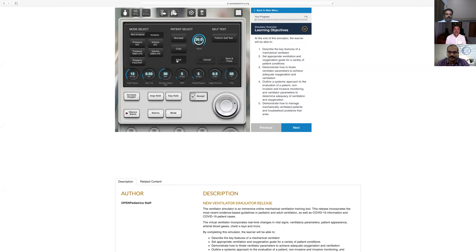Now I have to select the adult, then go for volume control. Once I go for volume control and accept it, you can see the buttons available — I have a tidal volume button. I can change the tidal volume. I will keep it at 500.